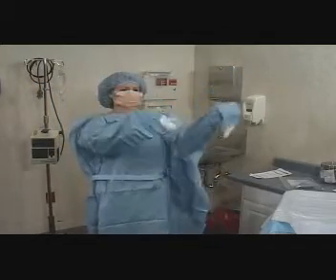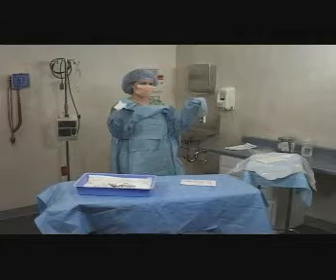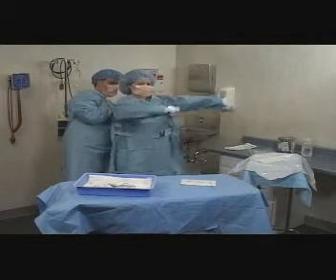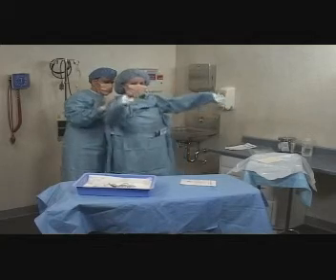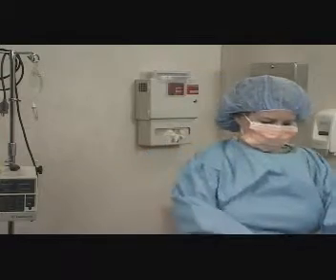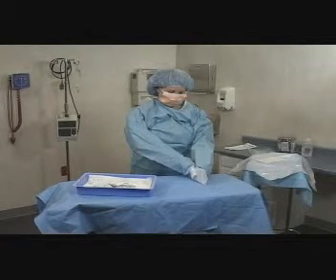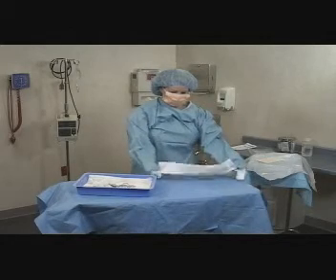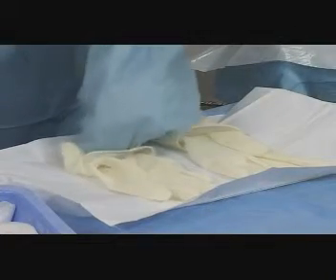Another masked and gloved staff member pulls the gown around her and over her shoulders and ties it. With her hands inside the sterile gown, she opens the inner packaging of the gloves on the sterile gown field. Using her non-dominant hand, which is still inside the sleeve, she picks up the glove for her dominant hand by its cuff and lays it on her dominant forearm.